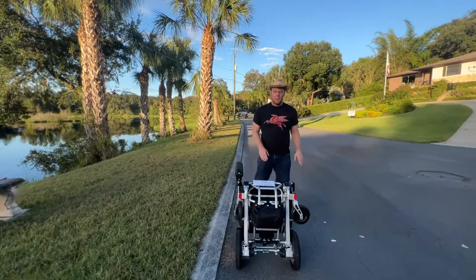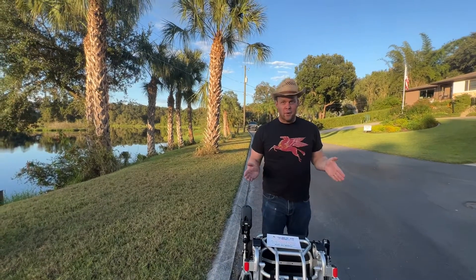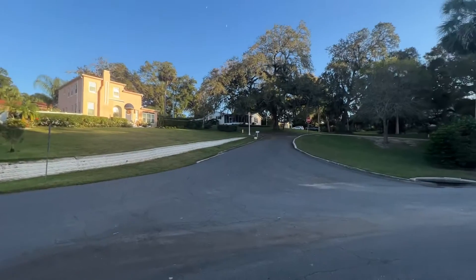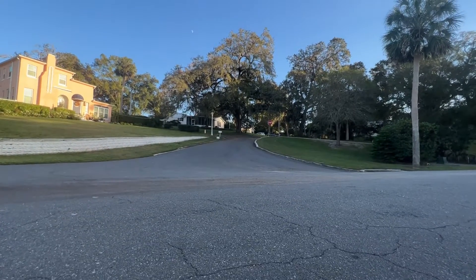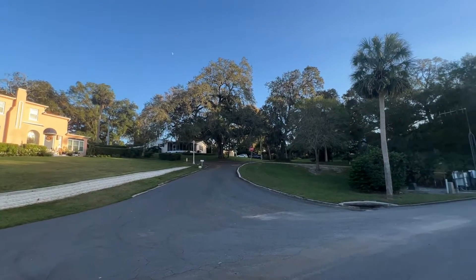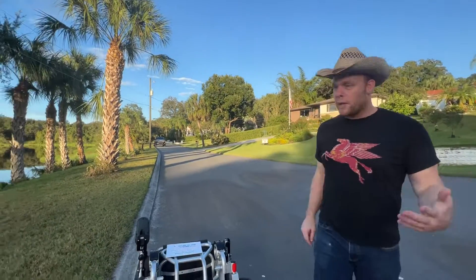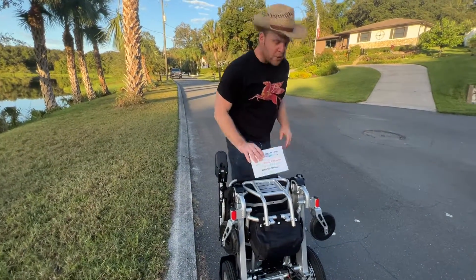Hello, this is Paul from QuickenMobile.com. We are on a beautiful November day in Florida. It's still hot, still sunny despite the sun starting to set. We are at the proving ground — the hill. I'm going to call this the hill of despair because we have acorns in our path, gravel in our path, an unbalanced and bumpy road, and areas significantly steeper than an ADA ramp or steeper than 8 degrees to go up and down.